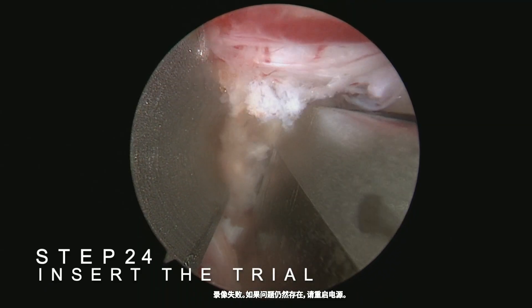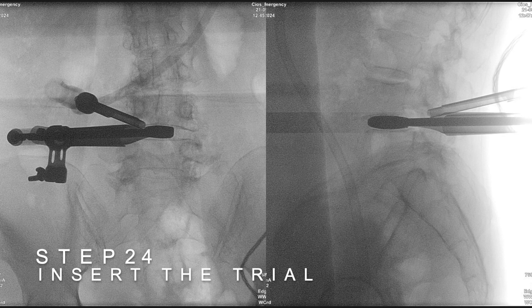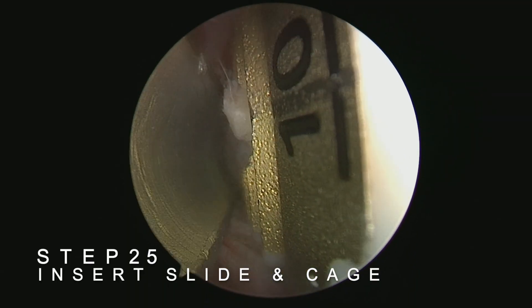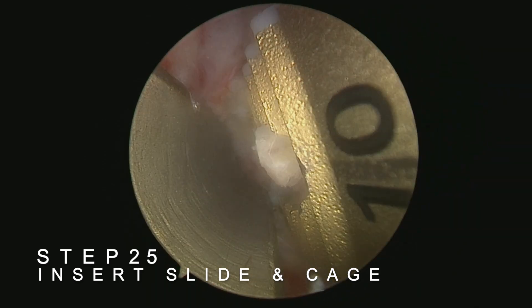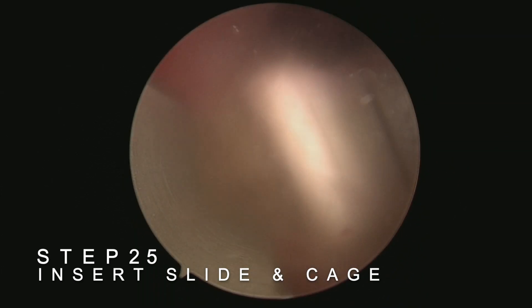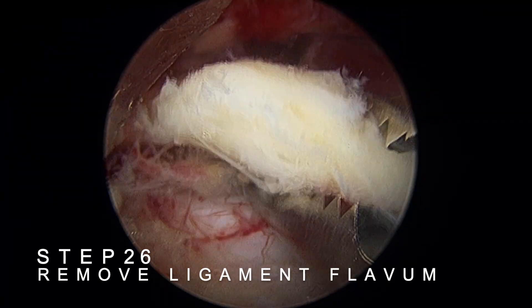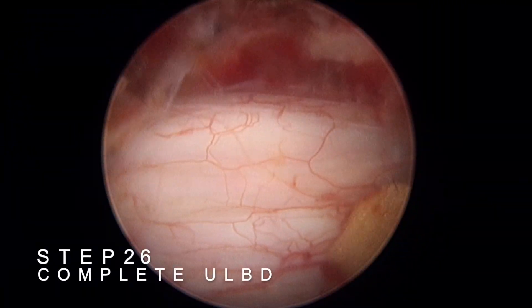Insert the trial with cage slide through the working portal. After testing the trial and selecting the appropriate size, insert the cage along with the cage slide. Once inserted, recheck to ensure the cage is not impinging on or injuring the nerves on both the medial and lateral sides. Finally, remove the previously mobilized but retained ligamentum flavum, completing the laminotomy with bilateral decompression.